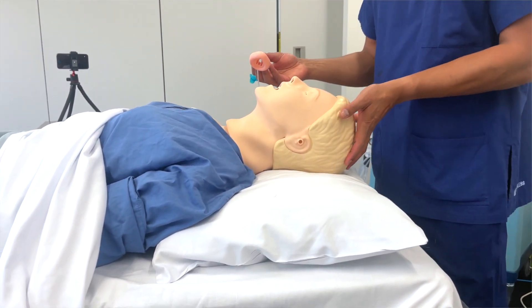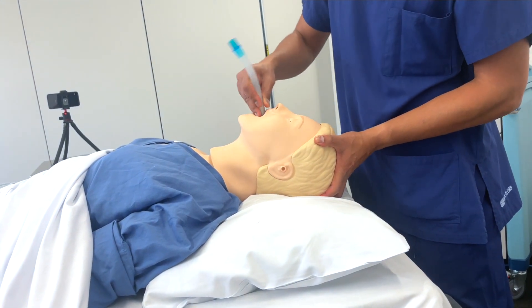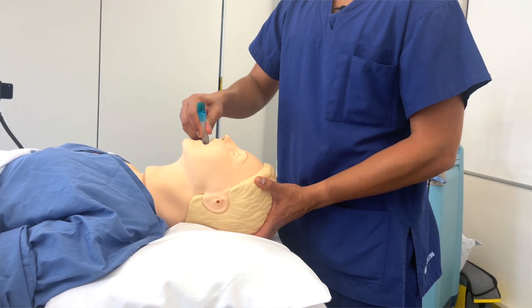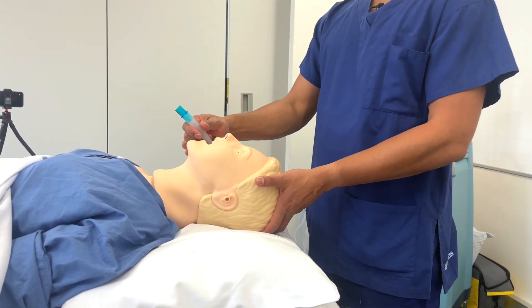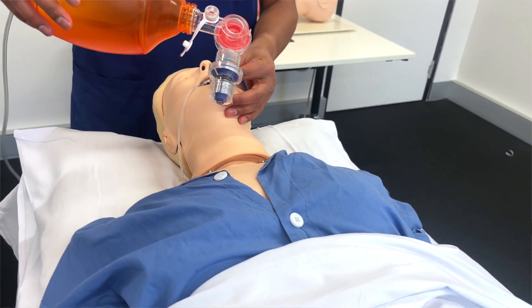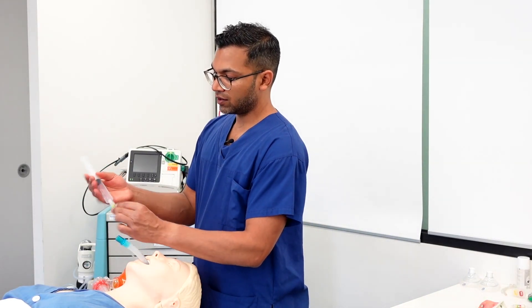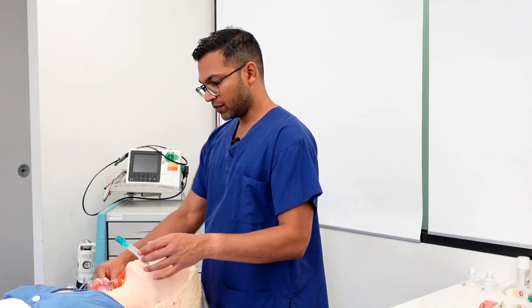To demonstrate the insertion again: I tilt the head back, get an assistant to open the mouth or open it myself. I push it past the teeth gently and then push backwards so it goes along the upper palate, hard palate, then down the soft palate, past the tongue, sitting just above the airway. As always, I check ventilation — you can see a rise and fall of the chest. Sometimes that's all you need; other times you'll inflate the cuff to create a better seal.